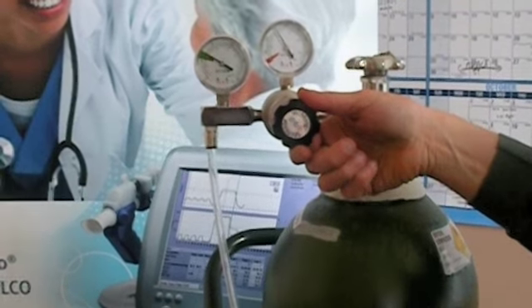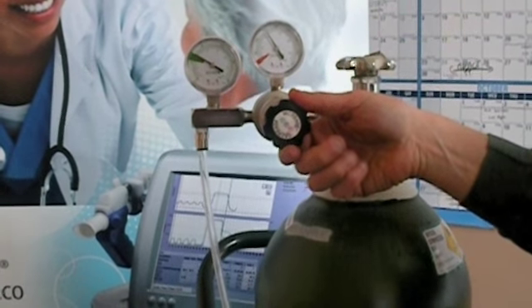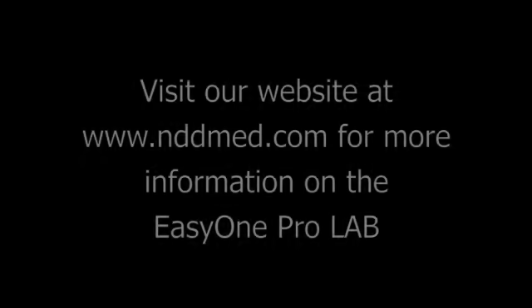Next, we want to increase the regulator until it's within range, which is shown in green.